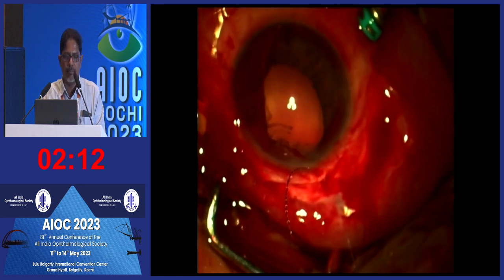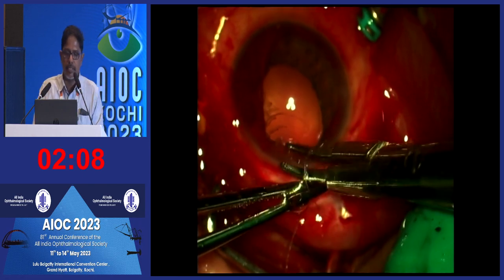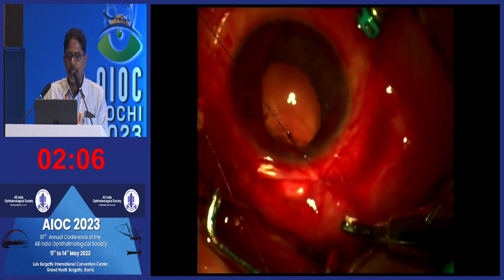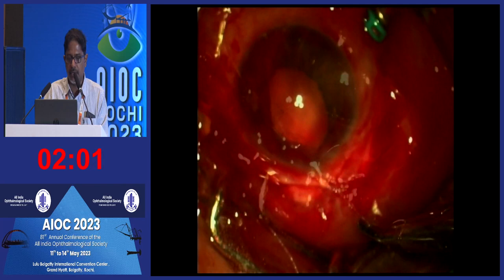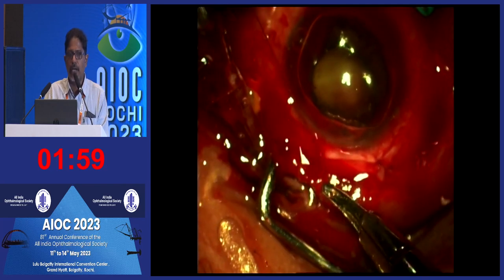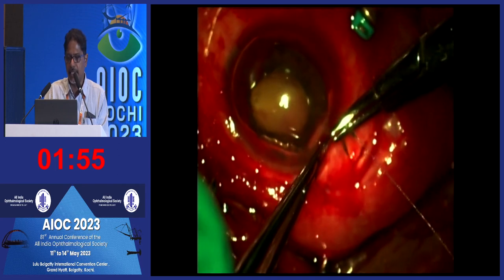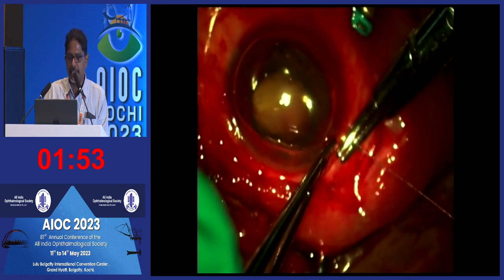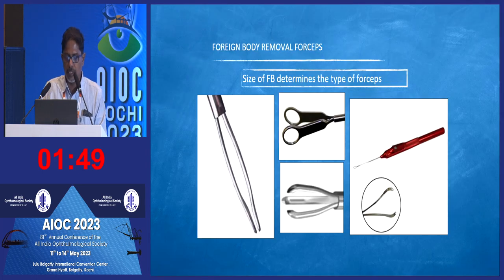If you have BSS going in, it immediately causes visibility loss. Also, when you make such a large exit wound for the removal of a large foreign body, the eye collapses, causing difficulty in visualization and an increase in bleeding. So oil helps to keep the media clear and keeps the globe stable and intact for easy access and removal of the foreign body.